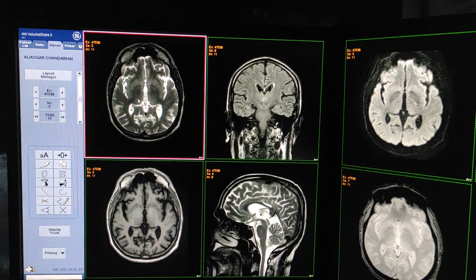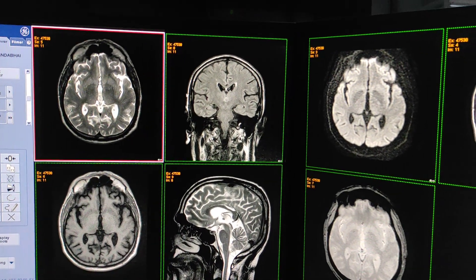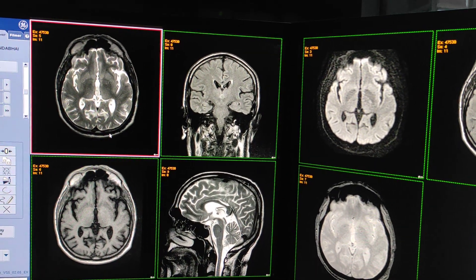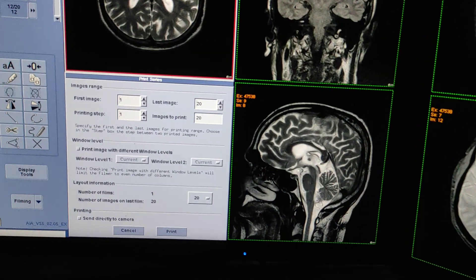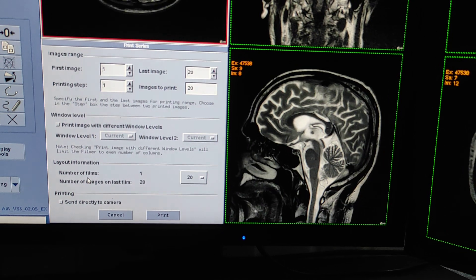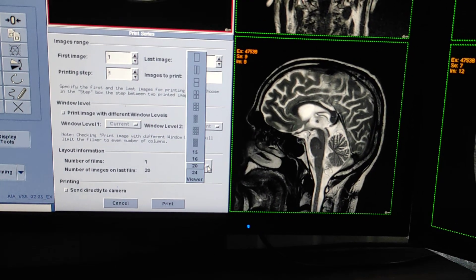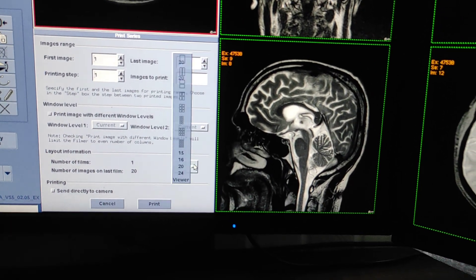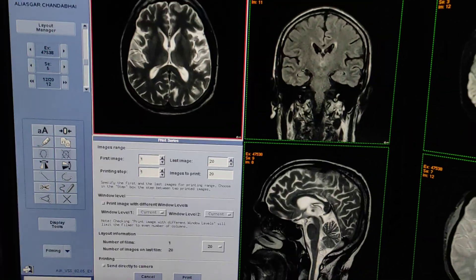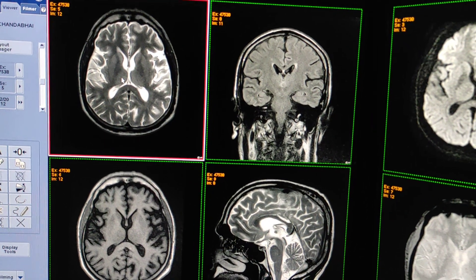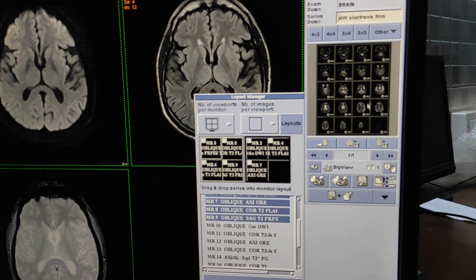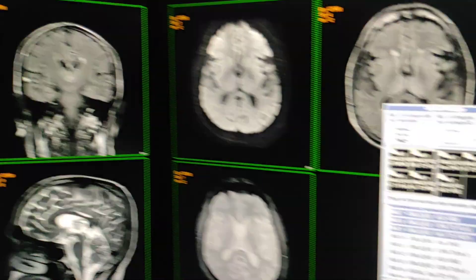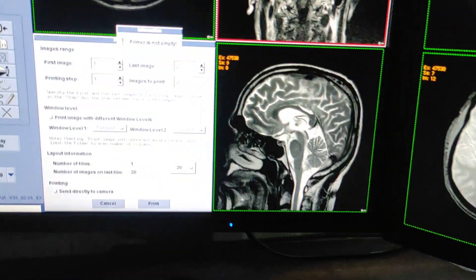For the first big film, you have to give axial T2 and axial FLAIR together — both sequences need big images. Click on the axial T2 box and press F4. This interface will open where you can select the number of films and number of images. The last film has 20 images, so select 20. It will automatically take a format of 20. Click on axial, then F4, and click print. The 20 images will go in a direct format of 20. Again, click on coronal FLAIR, press F4, then print.